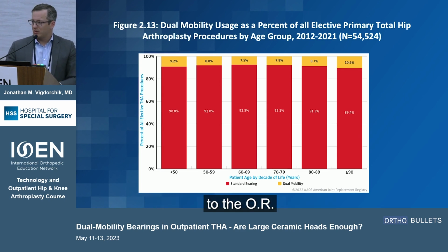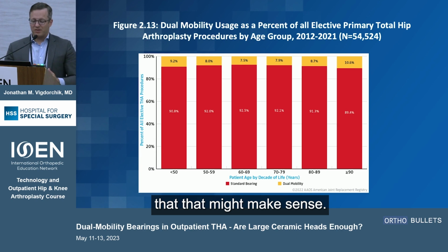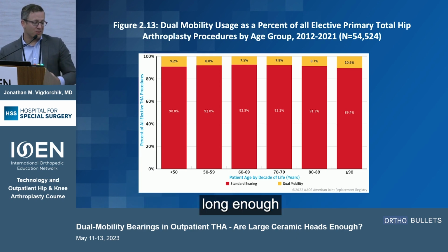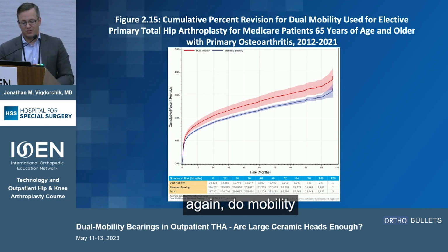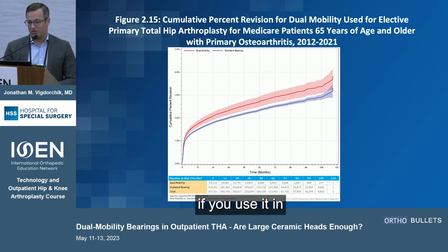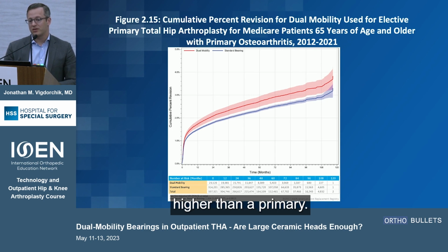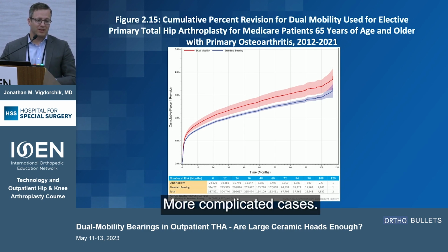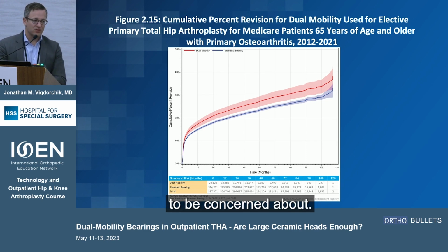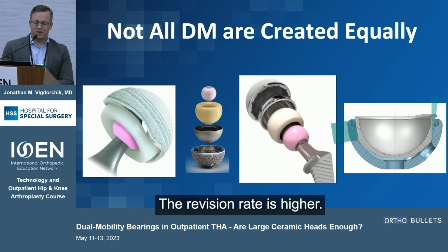You don't want to come back to the OR in an 80 or 90-year-old. That might make sense, and maybe they won't be around long enough to have any of these other risks. Maybe not. It's still costly. If you're thinking about this, again, dual mobility revision rate, if you use it in a primary, is actually higher than a primary. And you may say it's probably a little bit biased just because you're using dual mobility in more complicated cases, but just something to be concerned about, right? You're coming back, the revision rate is higher.